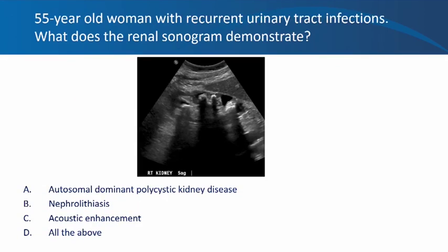Next question: a 55-year-old woman with recurrent urinary tract infections undergoes kidney ultrasound. Is the finding autosomal dominant polycystic kidney disease, nephrolithiasis, acoustic enhancement, or all of the above? In this longitudinal section of the right kidney, the orientation marker indicates upper pole at top. It is less likely ADPKD because there are no localized black cystic structures. Since acoustic enhancement is a property of cystic lesions, and we've ruled those out, we're left with nephrolithiasis as the correct answer.